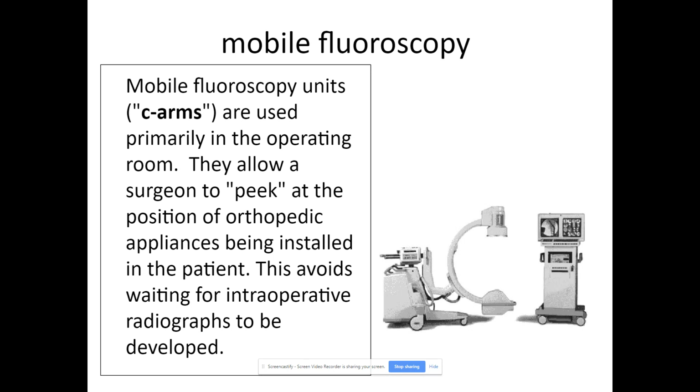There's a connection between these two that you don't see in this image, with a really big cable. And I got mad at one student once. I generally don't get really angry ever. But they had one half plugged in and the other half not, and then turned it on. Remember, we're talking about thousands and thousands of volts. So I was just like, turn it off. That was not good.